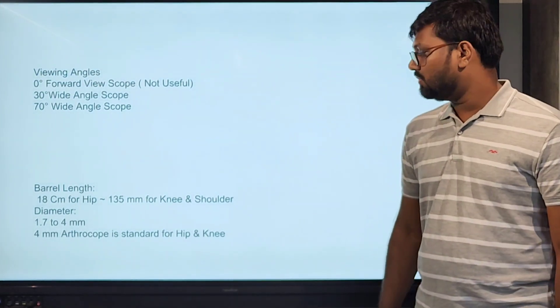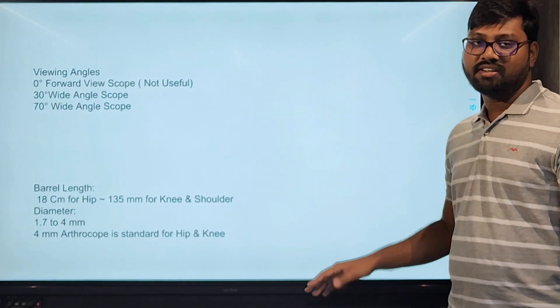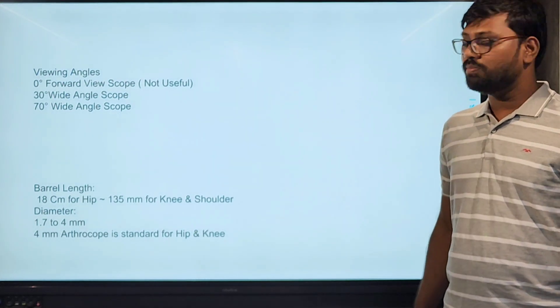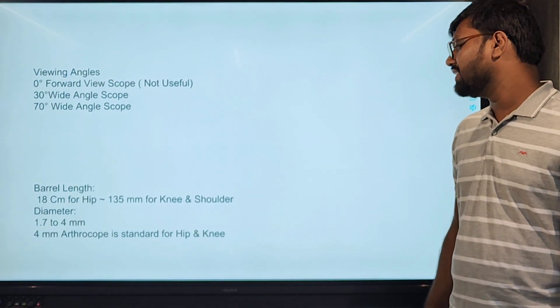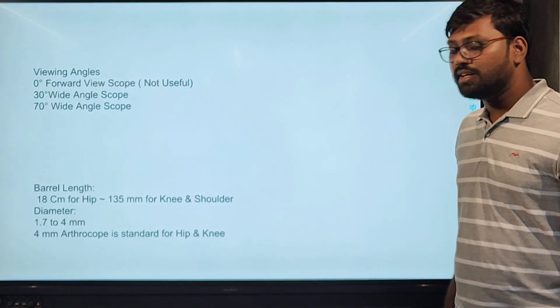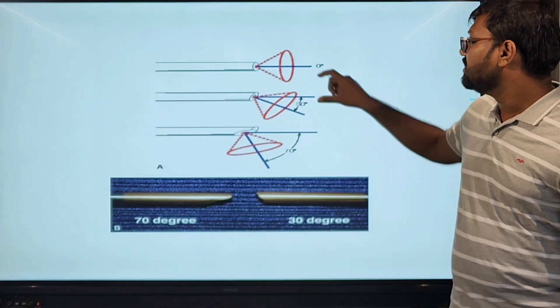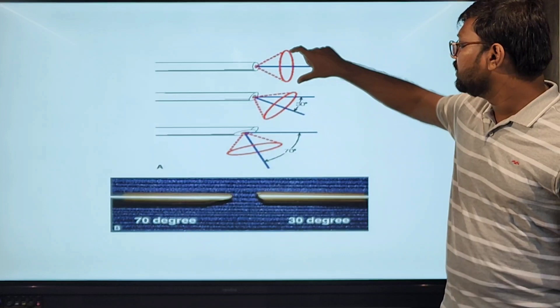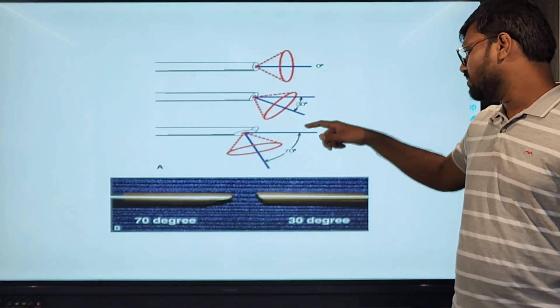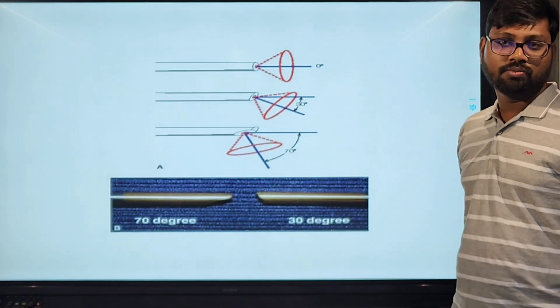The barrel length varies for various procedures — longer barrel lengths like 18cm for the hip, and an average 135mm for knee and shoulder arthroscopy. The diameter also varies from 1.7mm to 4mm. The 4mm arthroscope is standard for hip and knee arthroscopy. This is a 0-degree arthroscope with only a front view, and this is a 30-degree arthroscope which we can use in a rotating manner to cover a wider field of vision.